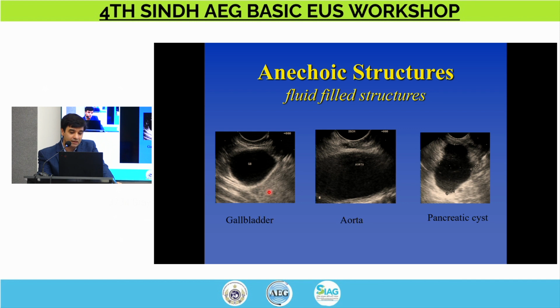And what you're looking at, the telltale sign here, is this area beyond that black structure. If you notice, if I were to draw straight lines coming out from this transducer, the lines in this area, the way this looks, it's blacker, it's darker than if I were to draw a line here coming out from the transducer and everything under it, right? This looks a little more white than most of this does.